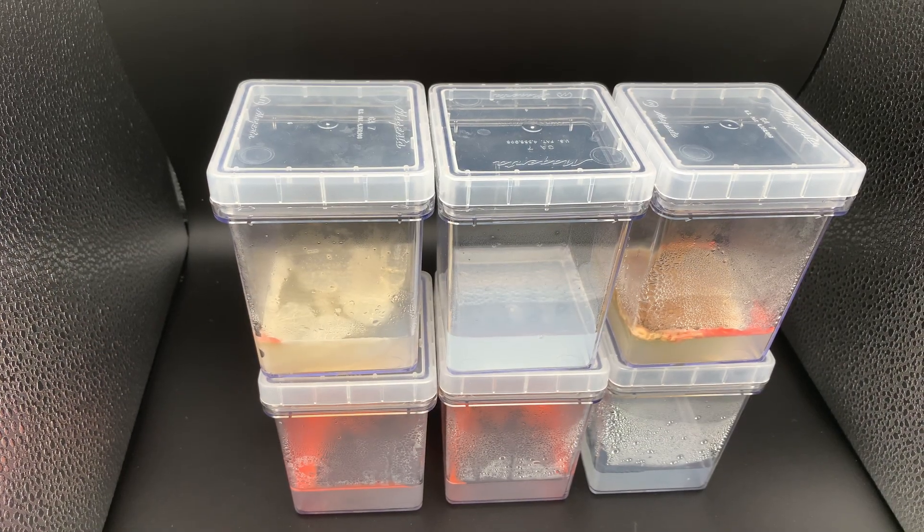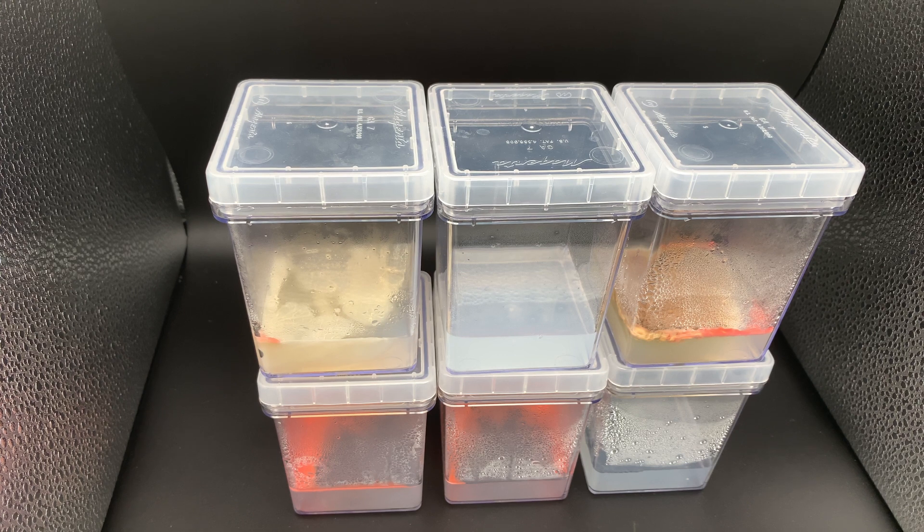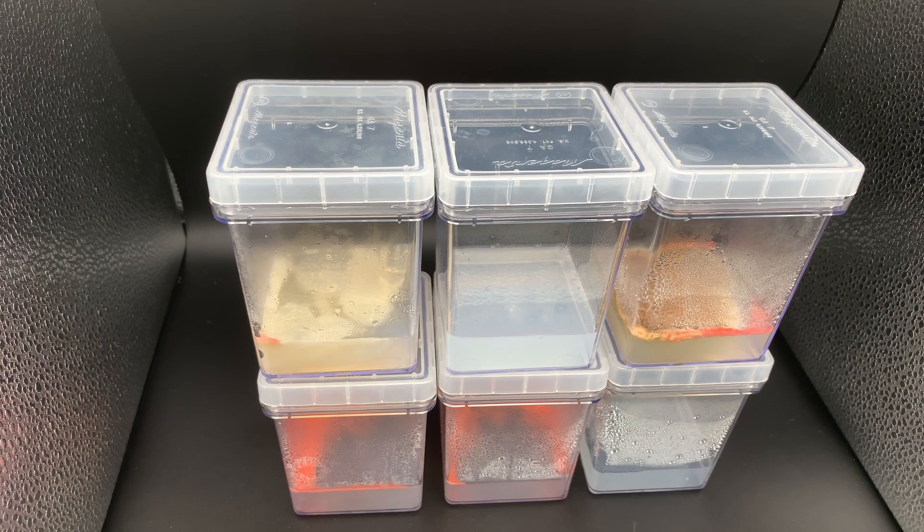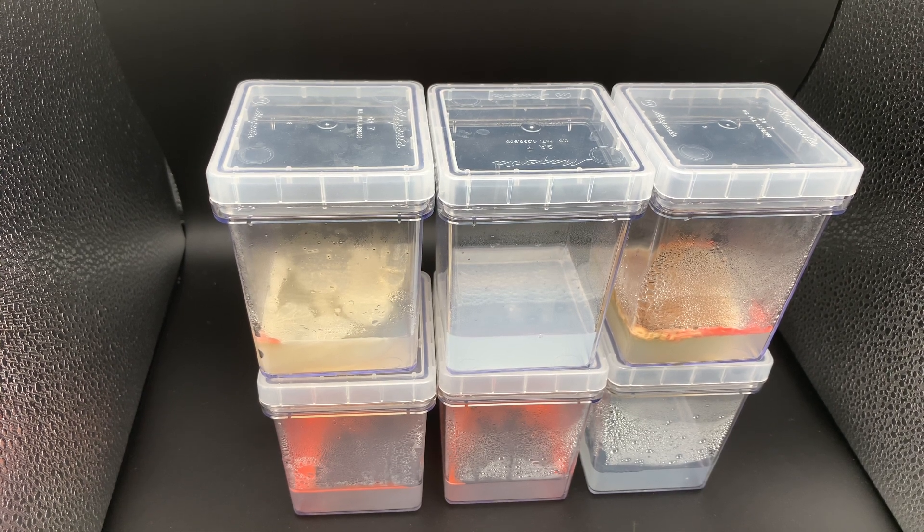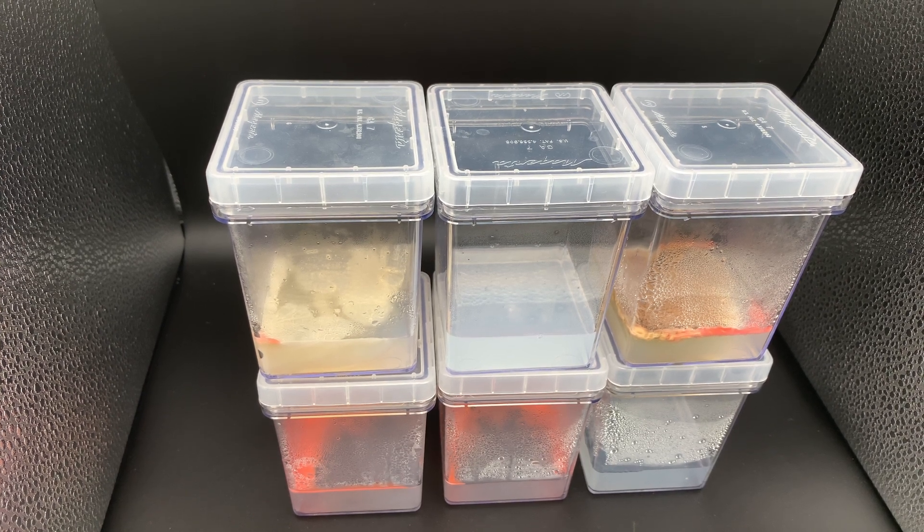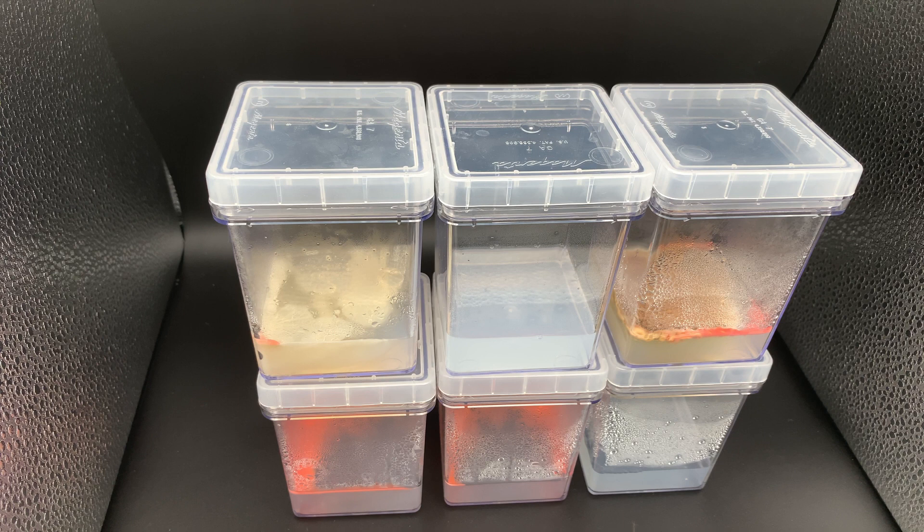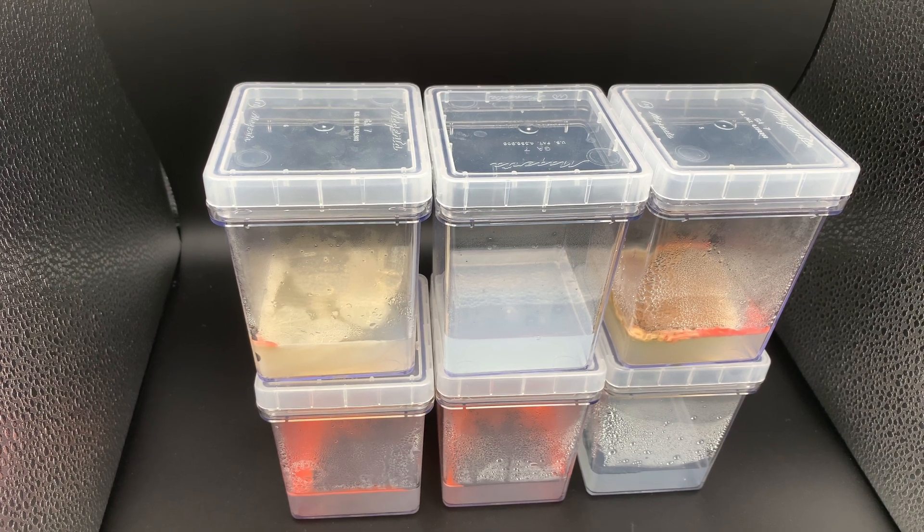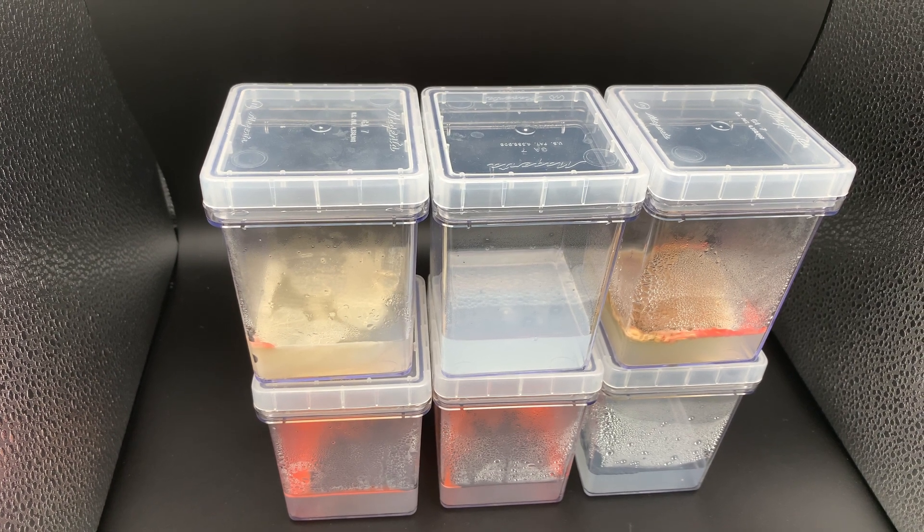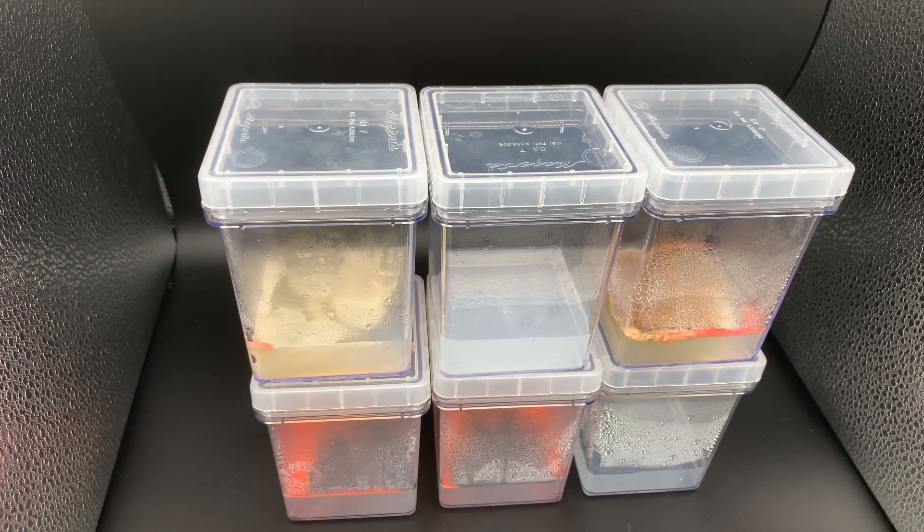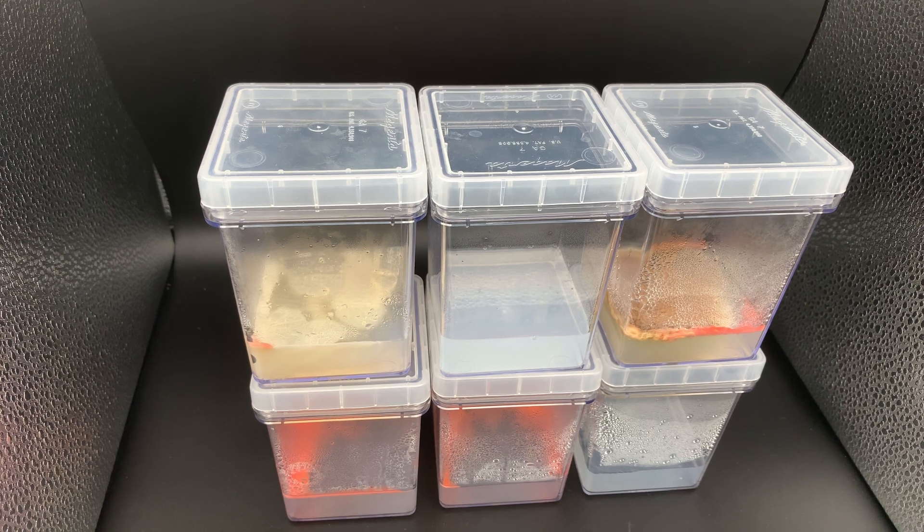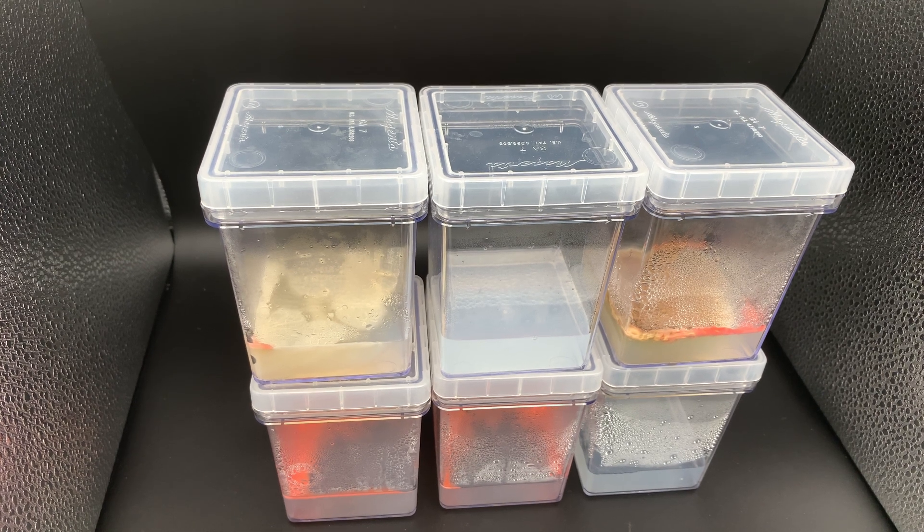As you saw on the time-lapse, most of the containers got contaminated, but we still have two that are still very clean - one with Agar and one with Kellan gum.